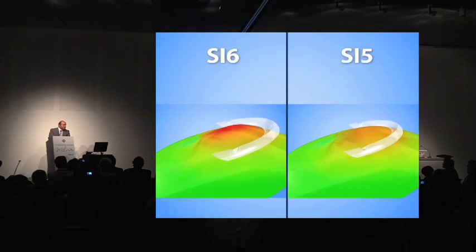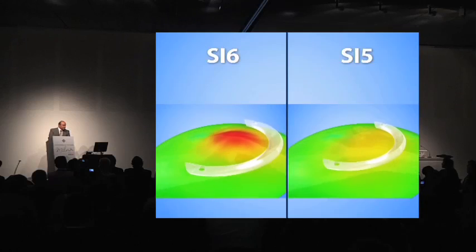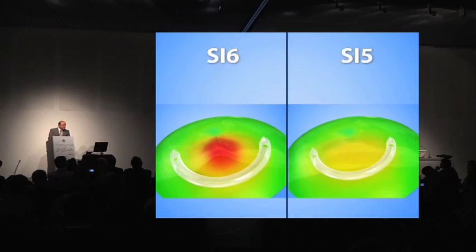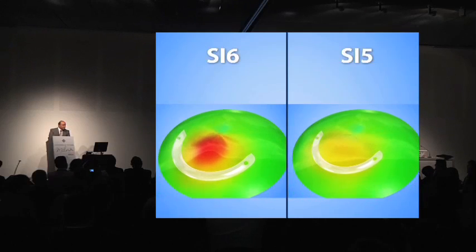This is the interface of the software — pre-op topography and simulated topography. We can enter one ring or two rings, and choose the diameter, thickness, and arc length.